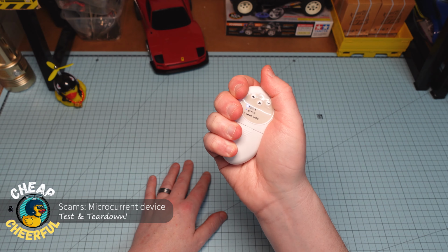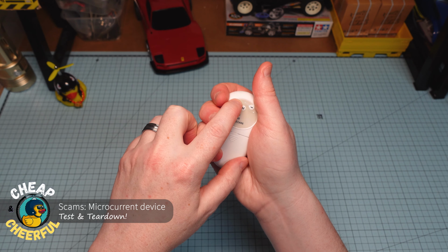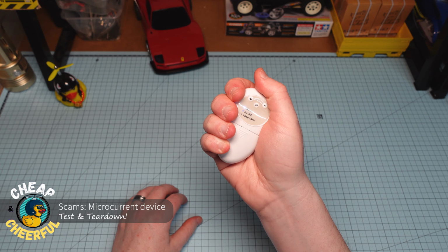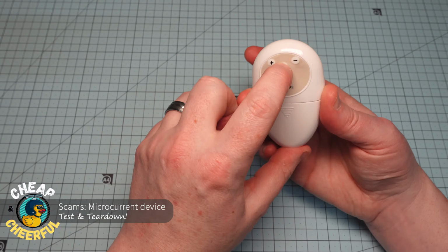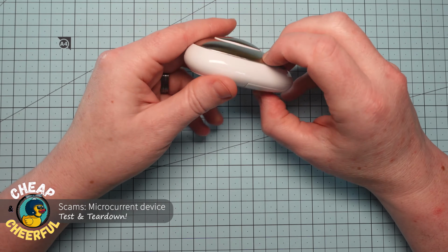It feels like I'm getting electrocuted, basically. Ooh, okay, yep. Turn it maybe up just 1. Ooh, yeah, yep. So that's far out. That's definitely not relaxing. Ooh, okay, I'm going to stop that now. That's enough. All right, let's see what's actually inside of this thing.